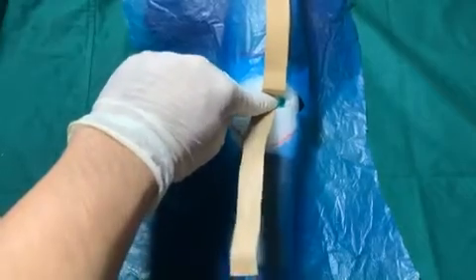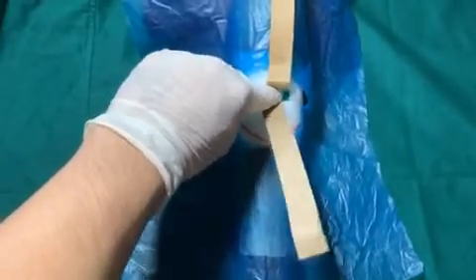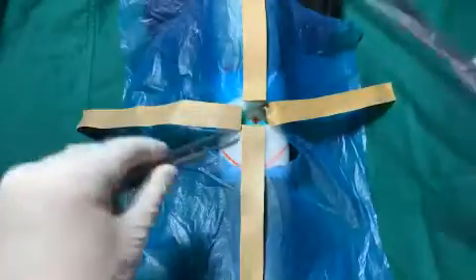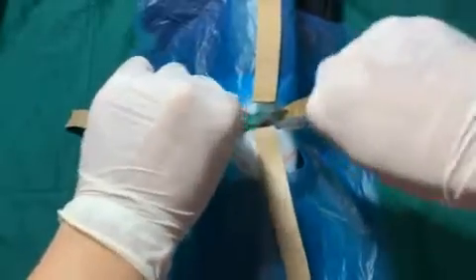Sometimes, you may encounter the thyroid isthmus that overlies the second and third tracheal rings. If encountered, retract the isthmus superiorly to expose the trachea. To expose the infrathyroid trachea, carefully part the overlying pretracheal fascia with a pair of scissors. Take care not to tear the inferior thyroid veins.